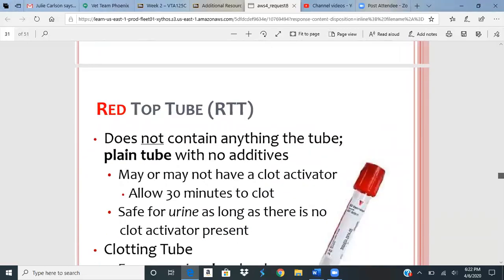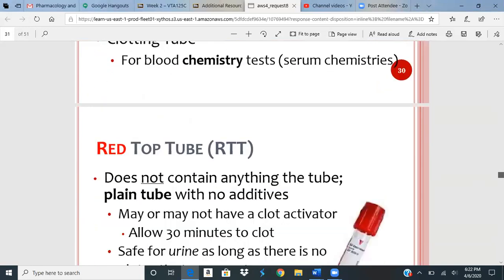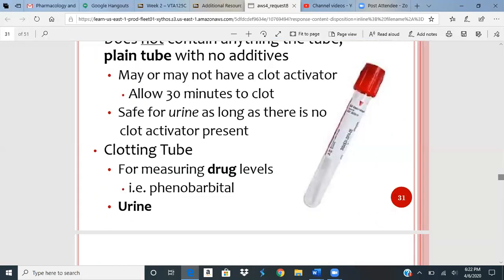Red top tube, these are kind of named for, of course, the way they look as well. So RTT, red top tube. Plain tube has no additives. We'll use this a lot for urine, or if we're going to do maybe drug levels. Phenobarbital is used for seizures. It's like a maintenance drug that they would need to be on daily if they were suffering from seizures. If it had some kind of clot activator, we would need to let it sit, let it clot, and then we'd centrifuge. Most of the time, though, at least what I want you guys to remember for now is that red top tubes are used for urine. There's nothing in them. We put urine in there and we use that to send out to the lab.